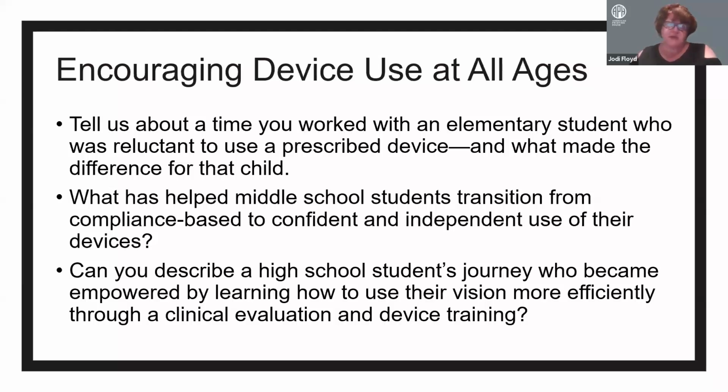Back in the old days, we had to use a Victor Stream, which actually did look like the first iPhones that came out. It was a big blocky thing with buttons on it. We also did training with this student outside of school hours. That's one of the things not everybody can offer a student, but we were able to meet the student outside of school hours and use the devices there, and help her build up her confidence so that she was then able to use them more effectively in the school environment.